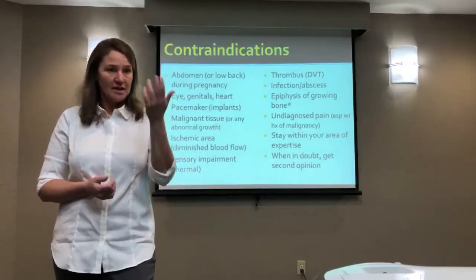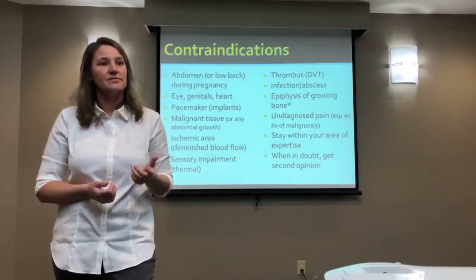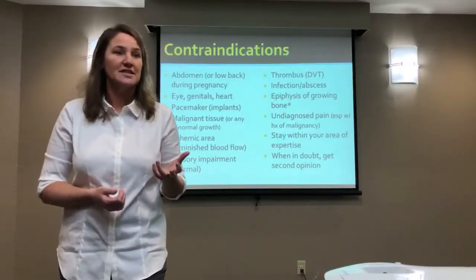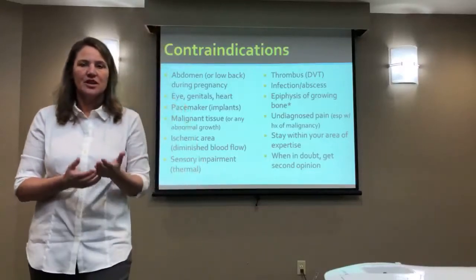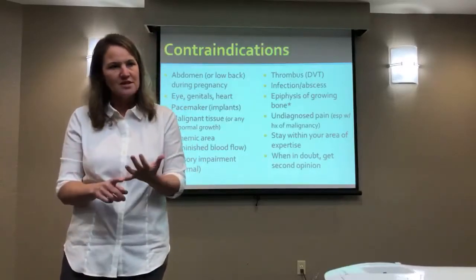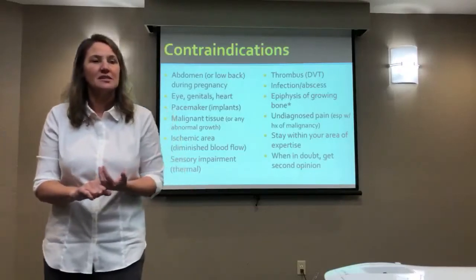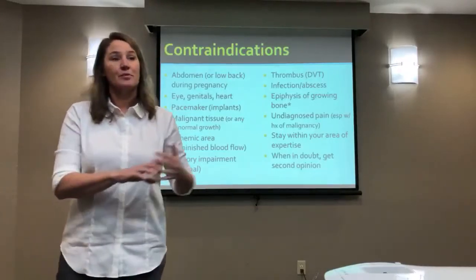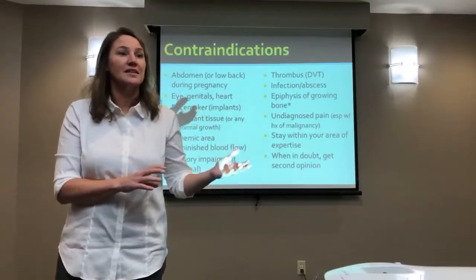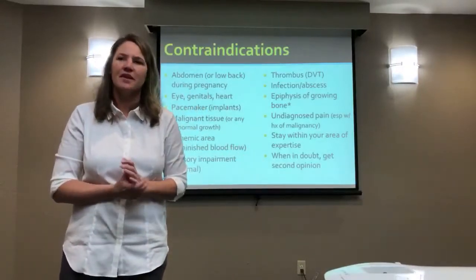What I also look at, and we can look at these things and communicate, is a lot of the studies we could argue were poorly designed. And I would look at it and say, well, gosh, no wonder their outcomes weren't good. It was either the choice of the patient wasn't a good choice, or the manner in which they delivered it wasn't what the previous studies had found were likely to work. So yes, there is a lot of controversy.